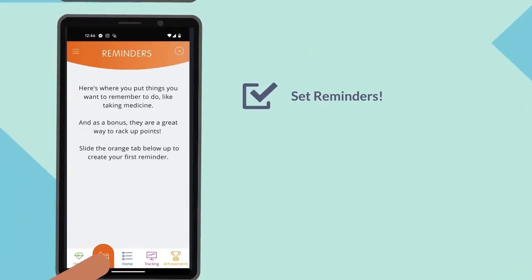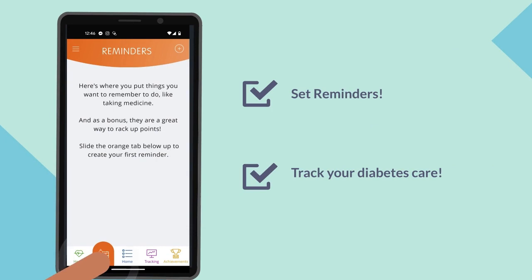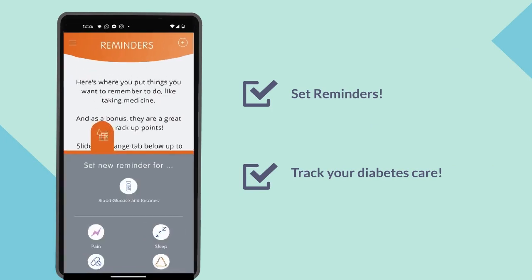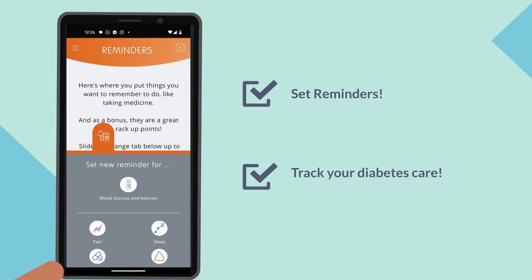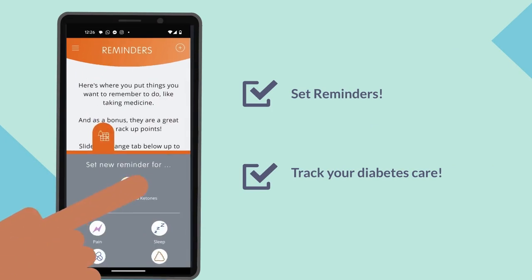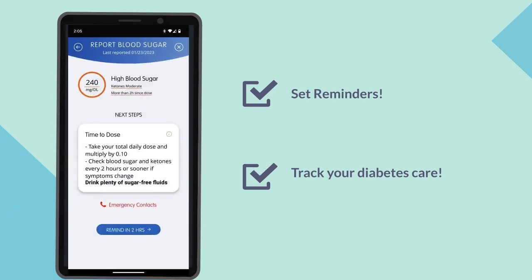The app also allows you to set reminders, such as taking medicine, insulin doses, and reporting your blood sugar levels.